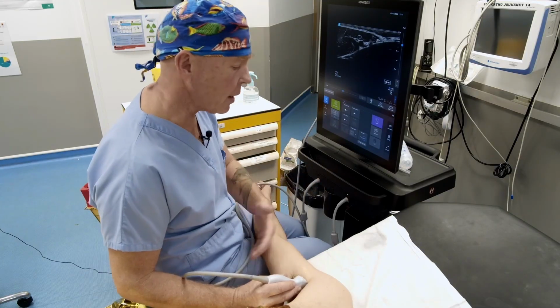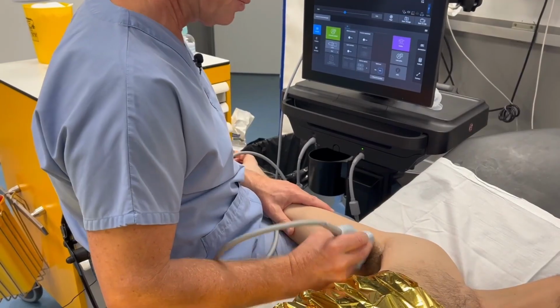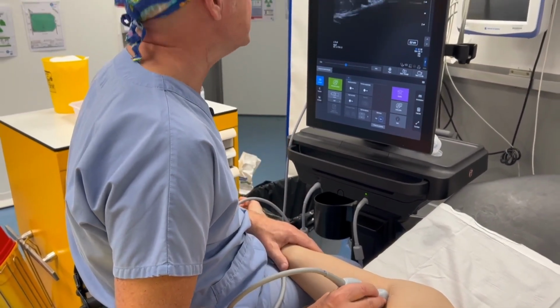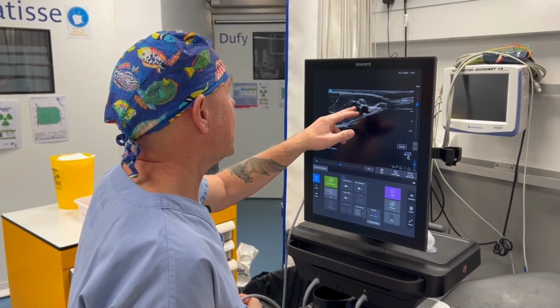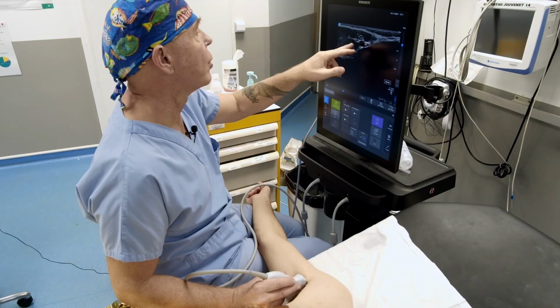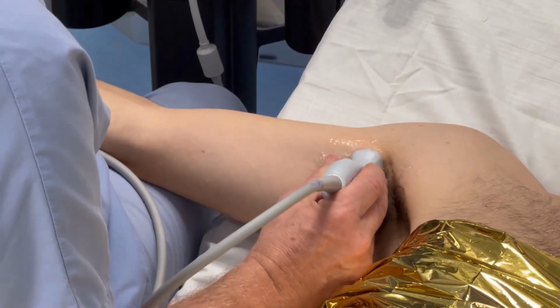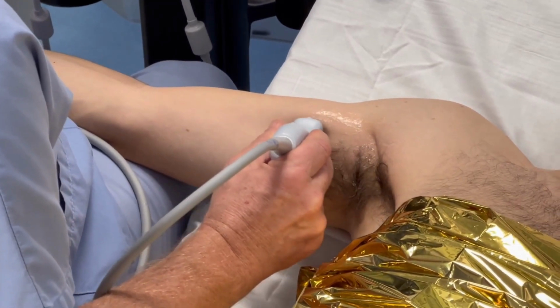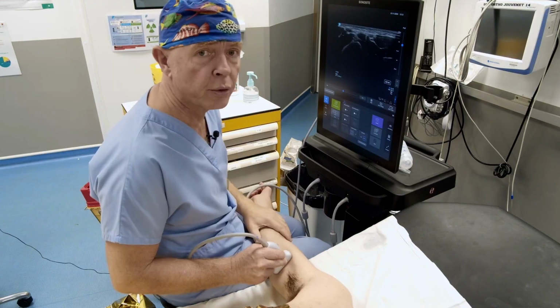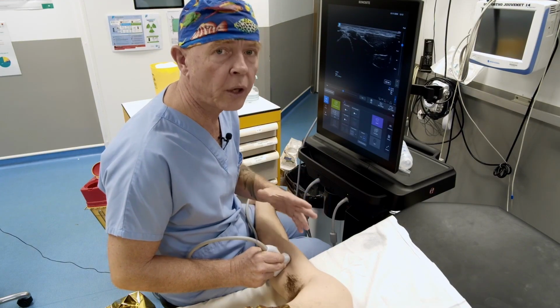So workshop number 4, do it on a volunteer. And then you spend about 15 minutes on each nerve. And then you practice identifying the elements we've seen and memorized. You follow the nerve bundles dynamically to make sure they are the intended anatomical structures. There is no need for neurostimulation. You know, the median nerve is clearly visible in this position. And if we keep following it dynamically, it will curve around the artery. So that's it for the artery, and that concludes the procedure for the ultrasound-guided axillary brachial plexus block.